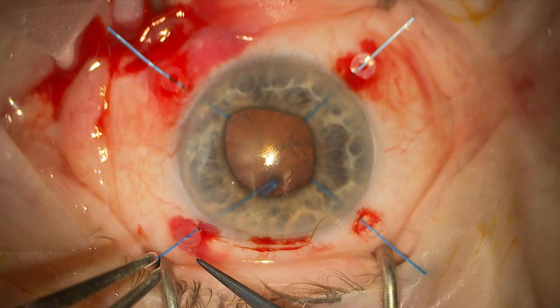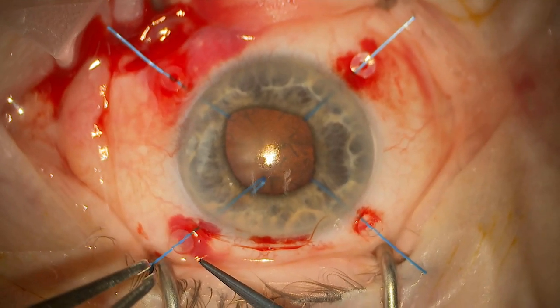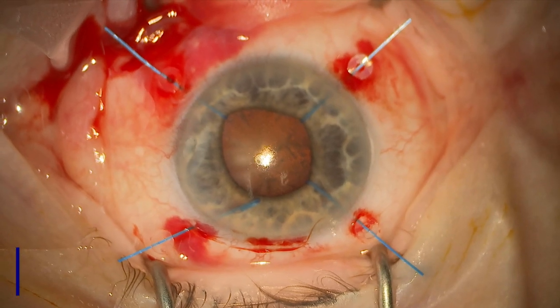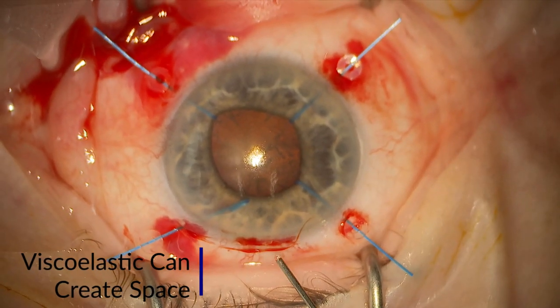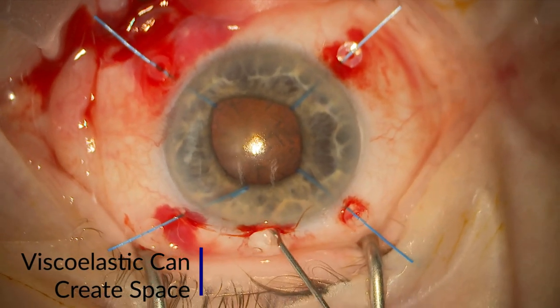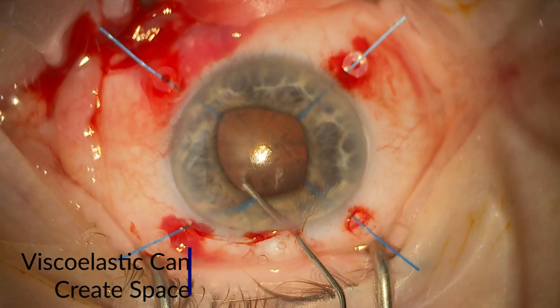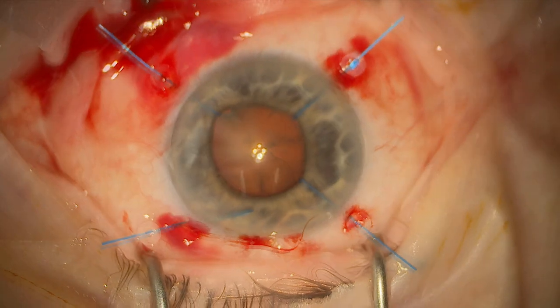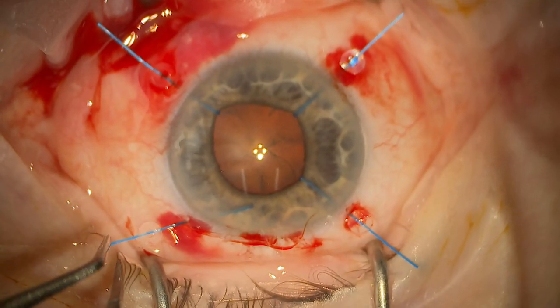You can see that I'm struggling to get this hook underneath the iris. The capsule and the iris are quite close together at this point. So what I'd recommend is to use viscoelastic — it's a great way to create space between the capsule and the iris, just to allow the iris to be hooked more easily. You can do this for all the hooks if you need to; I've only done this for the one.